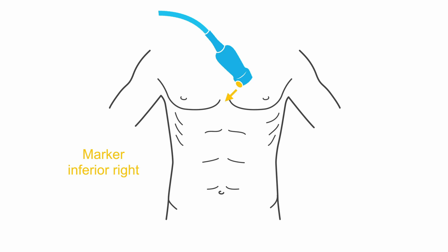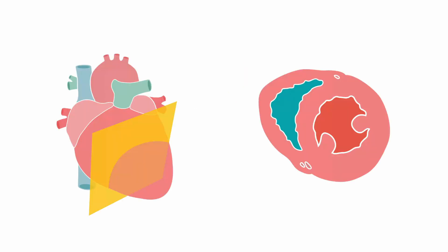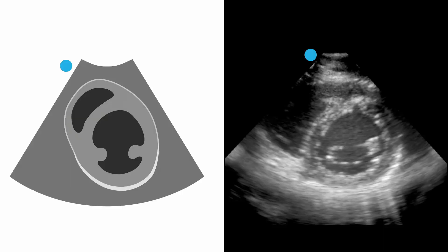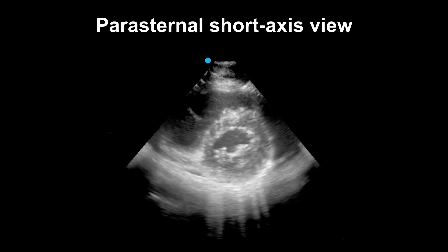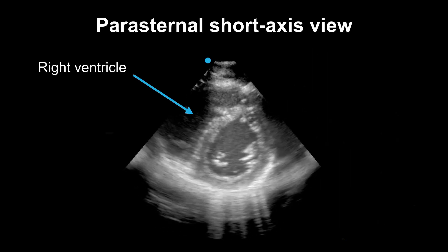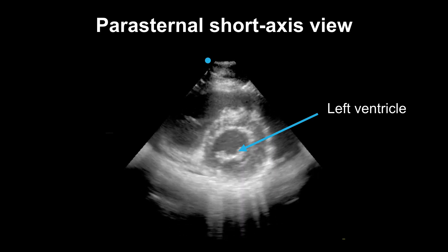Once you obtain your parasternal long axis view, it's very easy to obtain your parasternal short axis view. All you have to do is rotate your probe 90 degrees clockwise to now have your indicator towards your patient's right hip. You should have your right ventricle on the top of your screen and the left ventricle just adjacent to it — you will only see the two ventricles on this view. Notice your bright white septum in between the two ventricles.